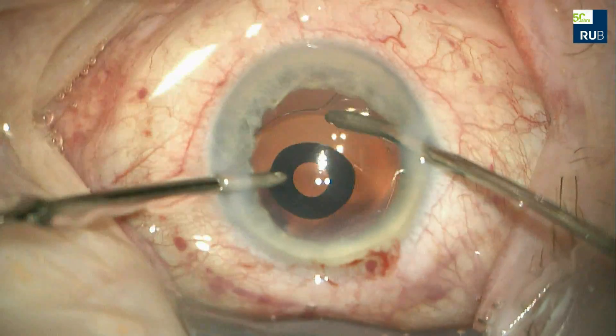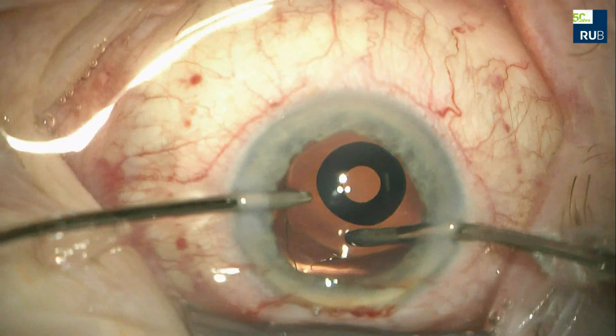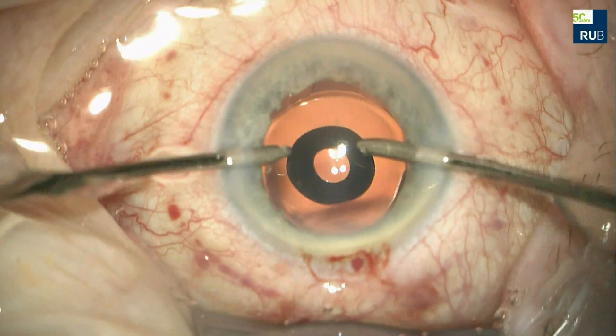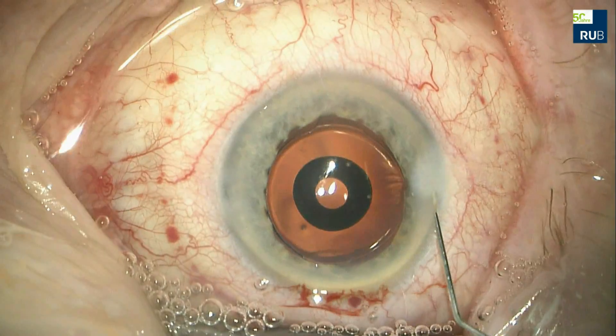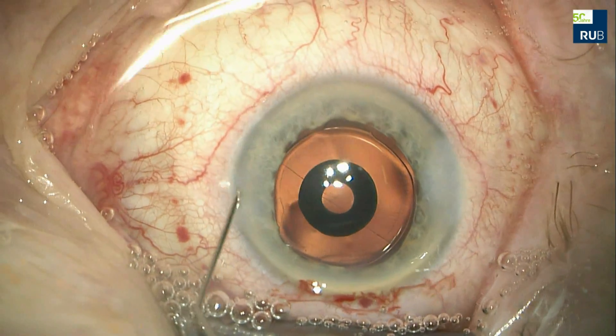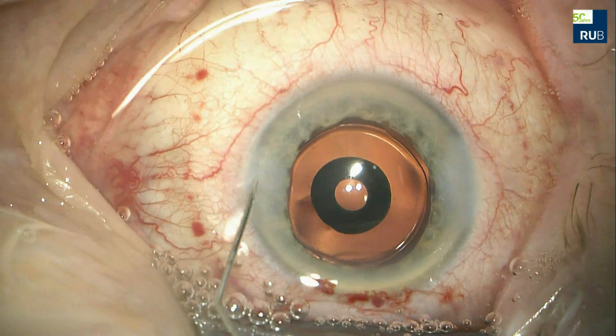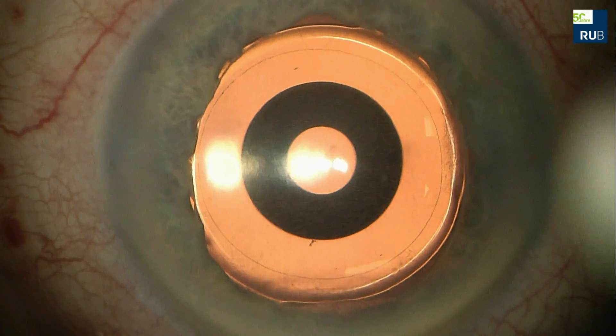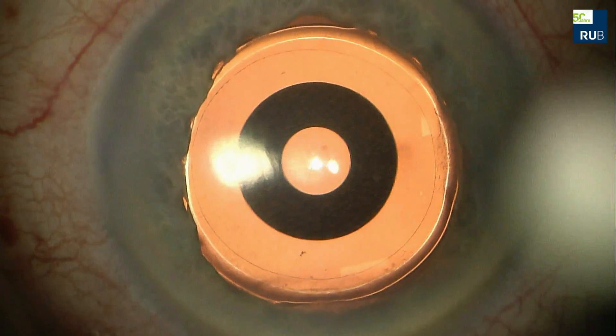The incisions are then hydrated for sealing. Centration of the IOL is verified based on Purkinje reflexes using a stereo coaxial microscope, in this case the Zeiss Lumera T.